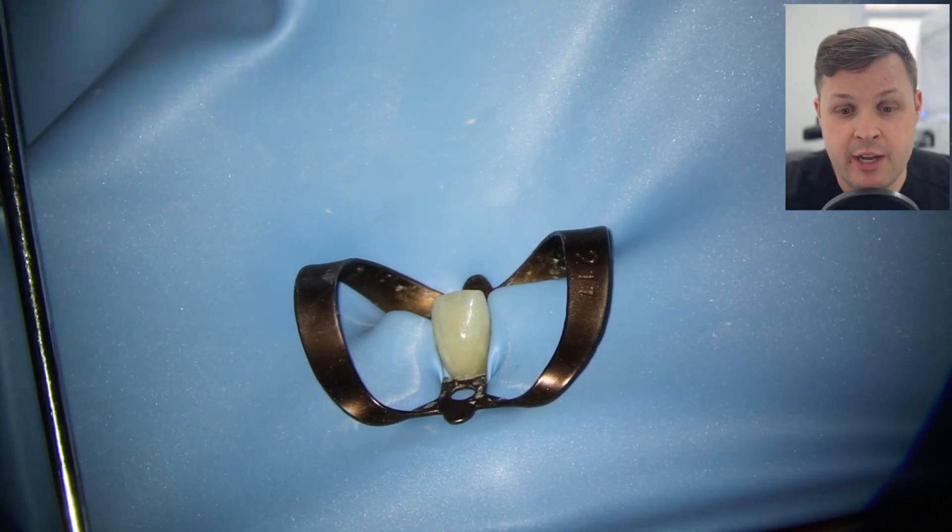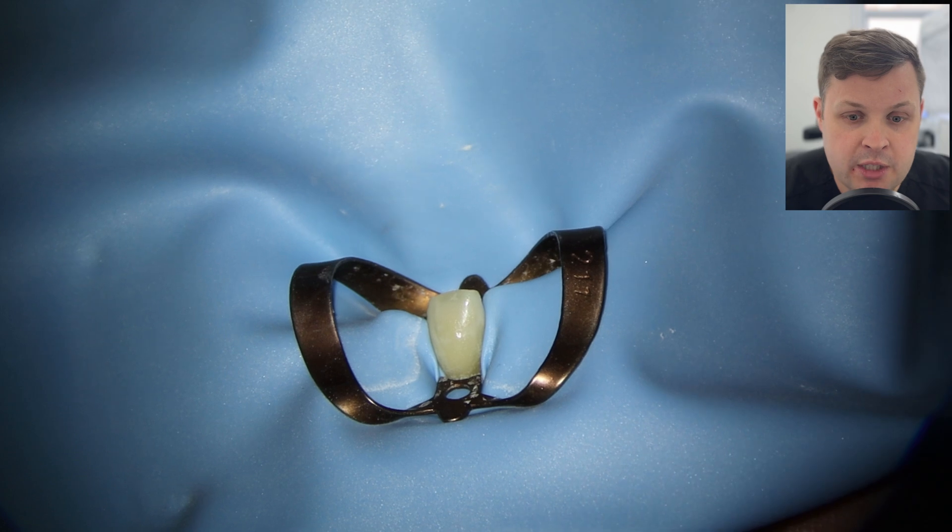I always like to take a post-op radiograph before filling it completely — a habit from when I was less experienced, and many endodontists do the same. 99 times out of 100 everything is fine, but that one time where there's extrusion of GP or a massive void, if you've already got a filling in place it can be very difficult to manage. So I've obturated the tooth but haven't filled it completely yet, and I'm going to take another post-op radiograph.